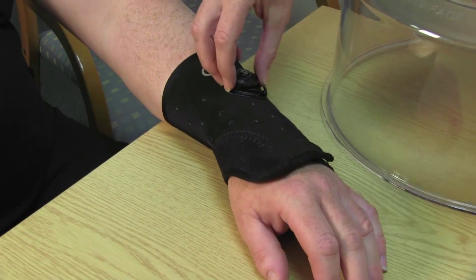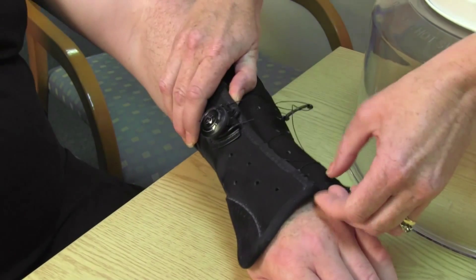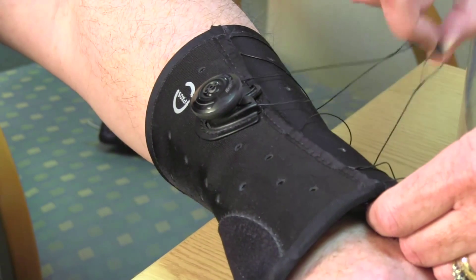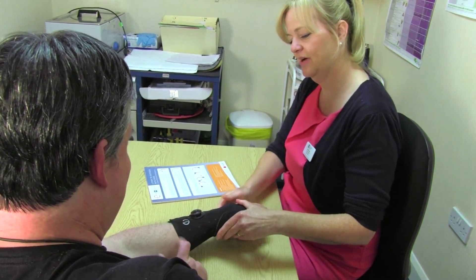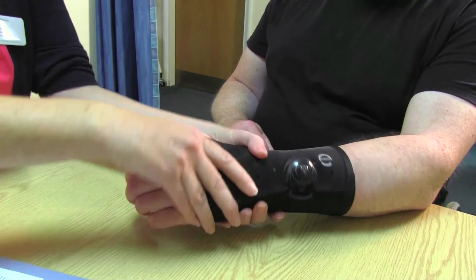It has this unique BOA system, which is an adjusting system that is helpful for the therapist when fitting it, but it also means that the patient can very easily self-adjust when it's in situ for subtle changes in swelling, temperature, and those sorts of things, to make sure that their splint is always fitting them no matter what. It's extremely well designed in the palm area, which means that it doesn't exclude any use of your fingers at all — it really does just immobilize the bit that needs to be immobilized.